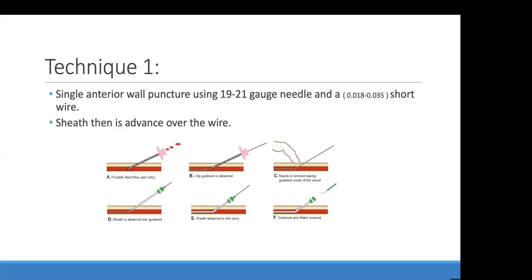If I have an intern fellow, and he's done 5 sticks, I usually allow 3, of course the artery is spastic and it will be difficult. So allow the hematoma to resolve by firm compression on it. Give some nitrate, that might help restore some of the radial pulse.